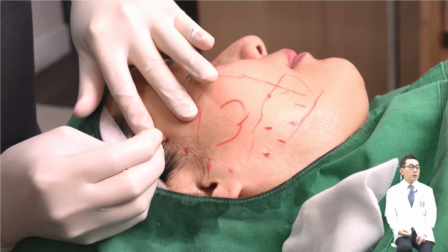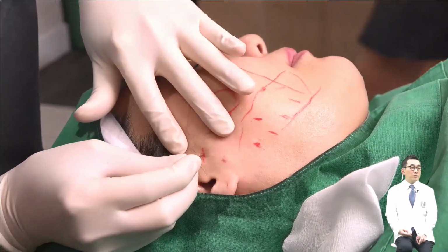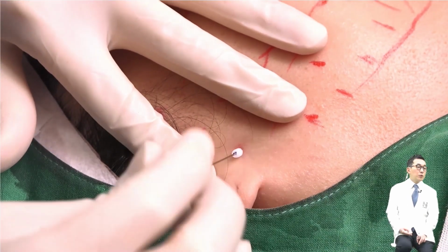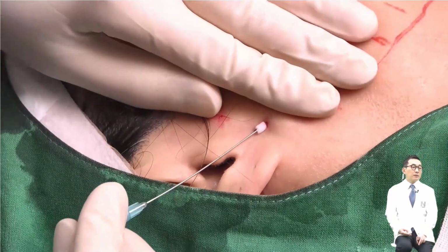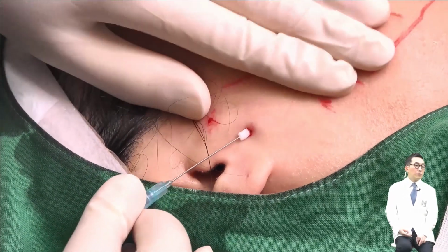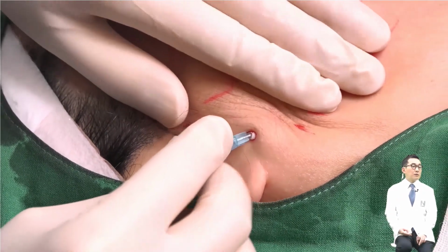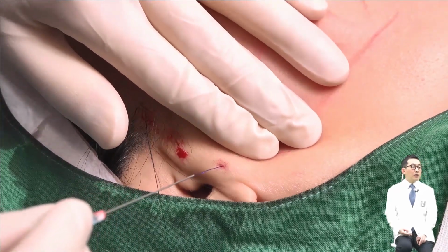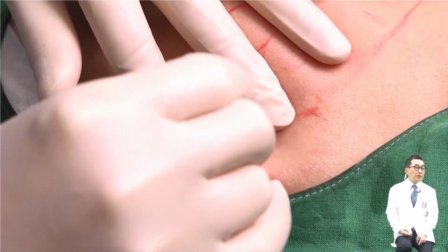This is the real procedure. After puncture at the 4 points per side, I put the thread starting from the lower point to the marionette line along the jawline. Inserting the thread is not different from the conventional method. Look at this. But after removing the cannula, I do not cut the outer end, but flip it and put it inside the skin again.